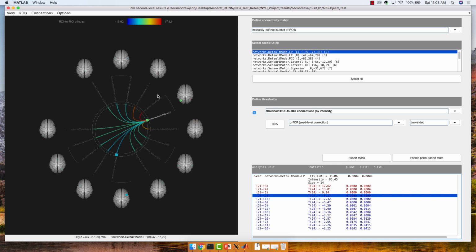Right? So, again, this really doesn't differ conceptually too much from everything you've done with a typical fMRI analysis. Right? We still have voxels, we still have corrections we need to do, but now we're just looking at a slightly different aspect of it. We're looking at the connections between all these different nodes, but still correcting for them, still running tests on them.